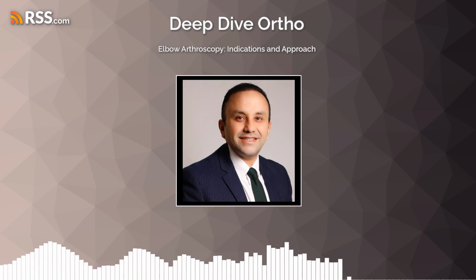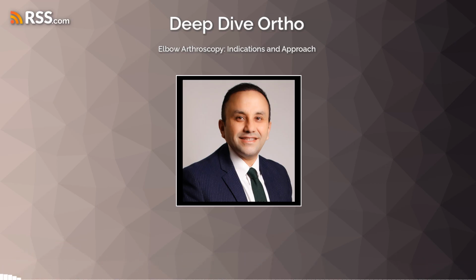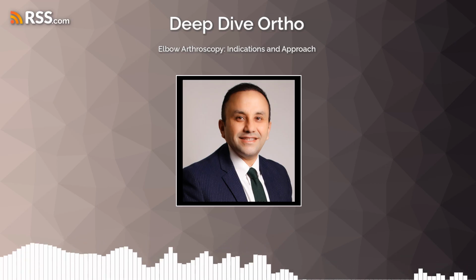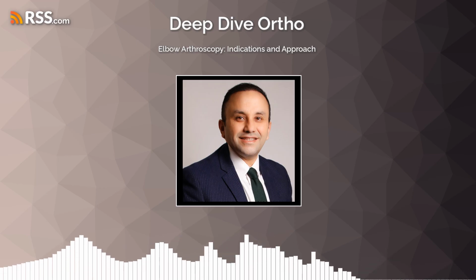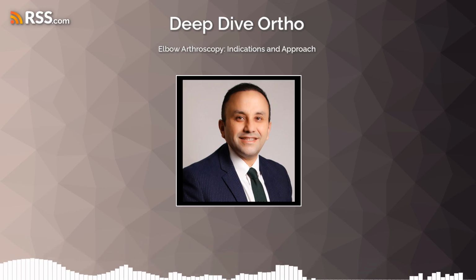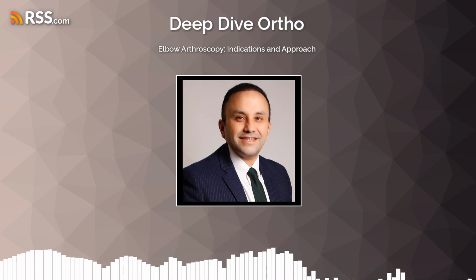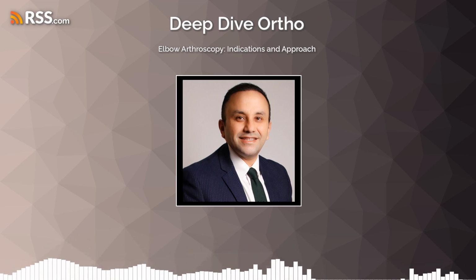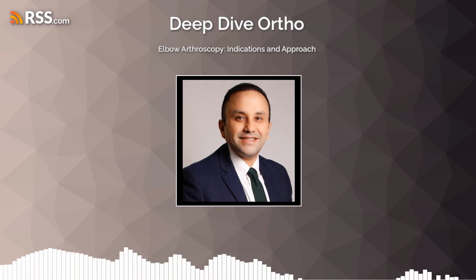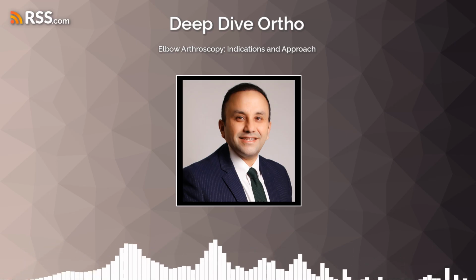The initial steps involve careful debridement of the capsule. If indicated, we also perform a synovectomy or synovial fringe excision using a shaver. Many surgeons, myself included, prefer a monopolar radiofrequency probe for tissue resection in this area because of its malleability. It can be bent to conform to the elbow's contours, often proving more effective for precise tissue removal than traditional hand instruments. More adaptable to the anatomy.